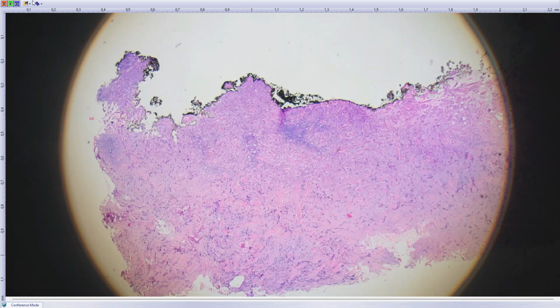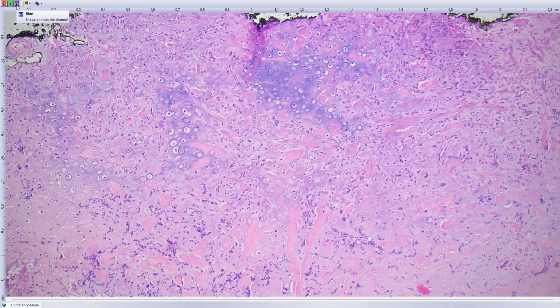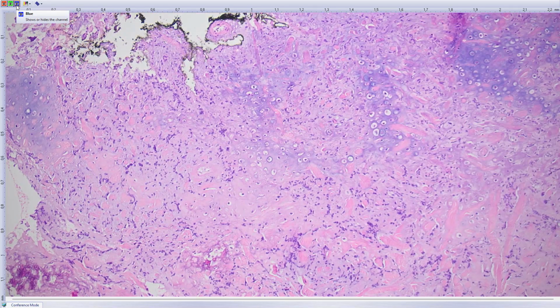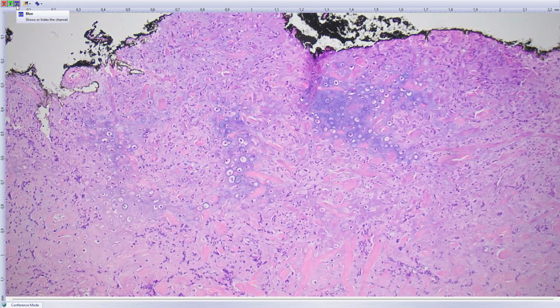And now she's got a lesion in her orbit. So it came as tumor of the orbit, and that's it, with no further clinical information. And one of our colleagues had the biopsy, and she performed keratins, which were negative, and she signed it out: fibrous tissue, blah, blah, blah, some cartilage present, no tumor there.